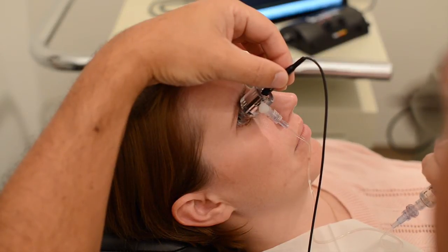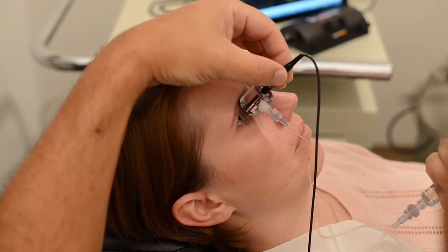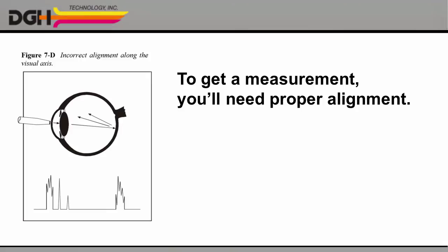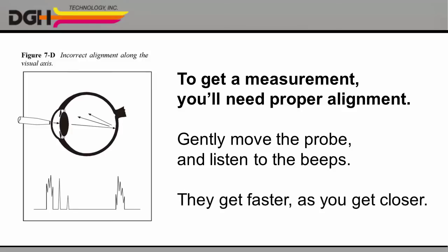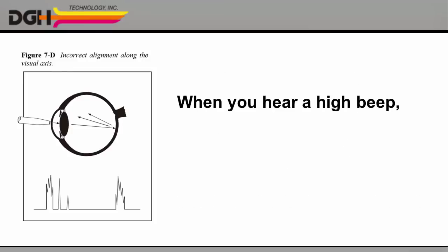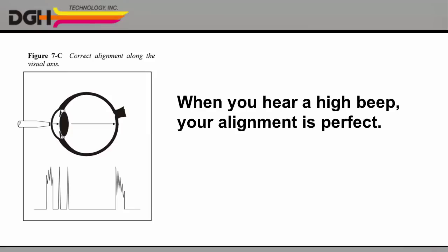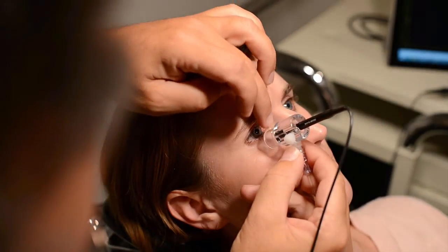When you've added enough, you'll hear a series of beeps as the unit automatically begins to detect the alignment of the probe. To get a measurement, you'll need to achieve proper alignment with the visual axis. Gently move the shell around the sphere of the eye and listen to the beeps. The faster they get, the closer you are to correct alignment. When you hear a high-pitched beep, hold still. Your alignment is perfect. Each high-pitched beep indicates a successful measurement being recorded. With practice, the whole process will be effortless.